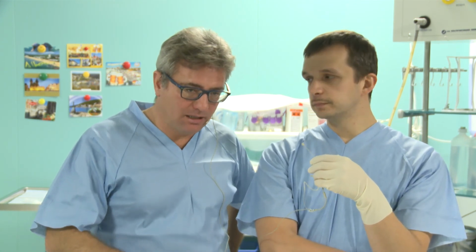And if I'm not sure that it is an inflammatory collection, I don't drain it, because if you place a stent in a patient who has a neoplastic cystic lesion, you can make a big mistake.